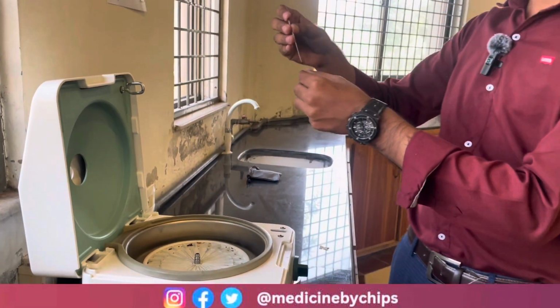Now we will discuss the buffy coat. As you can see, there is a small layer, a yellowish, white cloudy layer. It is known as the buffy coat. It contains leukocytes and platelets. So that was the experiment.